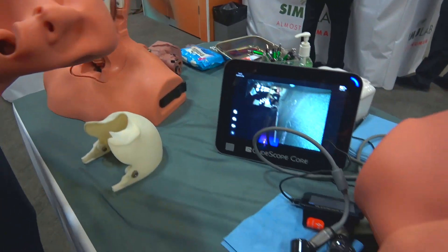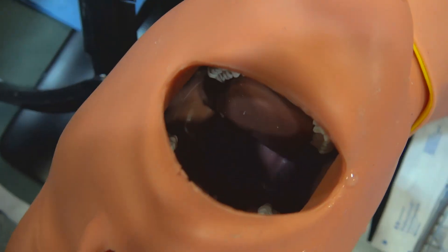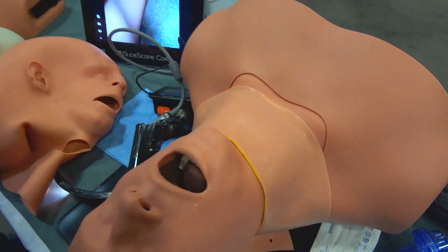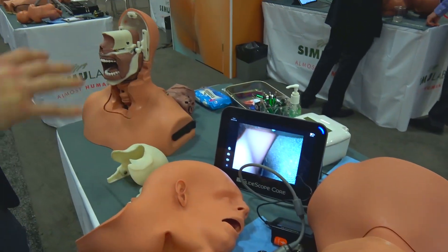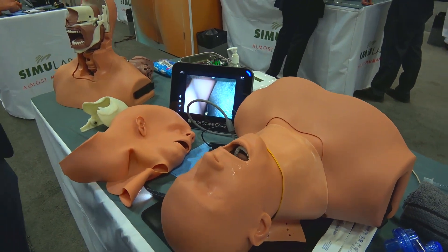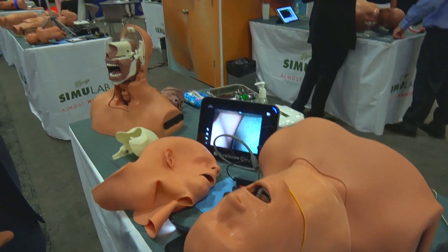All these replaceables can be taken out of the Simulab tissue allowance program and ready to go for you on your doorstep within the next couple of days. That is our concept with Airway Man — an easy to use, inexpensive trainer that includes the lifelike soft tissue that Simulab has been producing for the past two decades, and we're very excited about it.